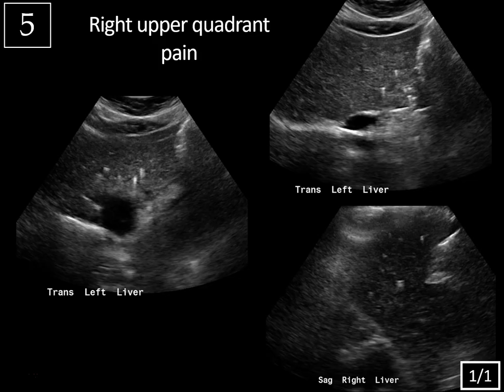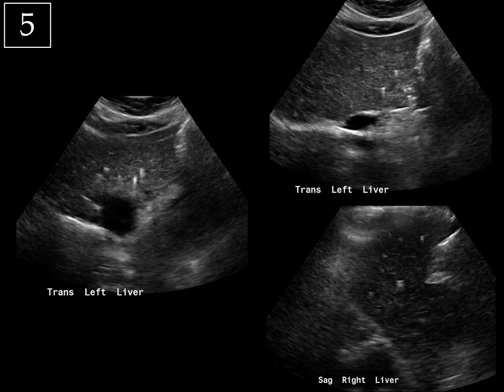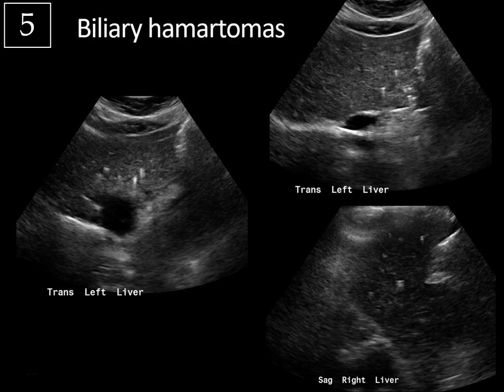Last case, history of right upper quadrant pain, slide one of one. Multiple images of the liver here, and there are these vague little punctate areas of comet-tail reverberation artifacts scattered throughout the liver. So this is comet-tail artifact, but it's not in the gallbladder, which looks normal here — so this is not adenomyomatosis. If you look closely, there are these little anechoic foci just interior to these areas of artifact. Scattered areas of comet-tail artifact throughout the liver parenchyma — that's typical for biliary hamartomas. These are actually benign malformations of the biliary tract that are asymptomatic and don't require any treatment. So that history of right upper quadrant pain was a distractor.